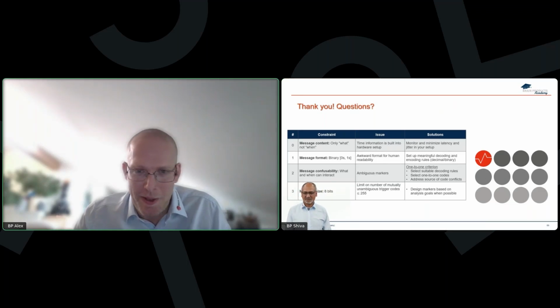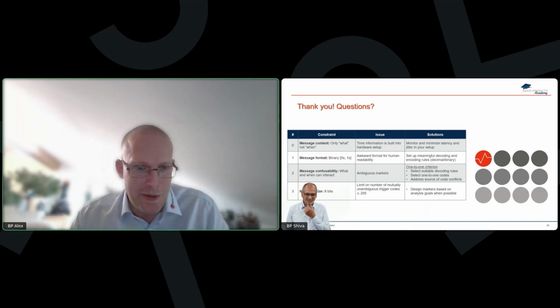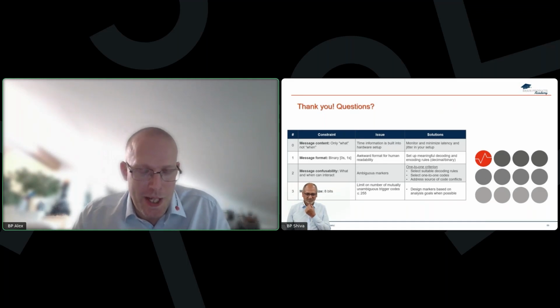Yeah, I don't think there's much more to say. As you said, sometimes this is necessary, but it comes with additional considerations you have to take into account because it changes the nature of the original pulse. So again, please check our resources if you have a trigger source that provides short pulses, and make sure you don't miss any triggers or get the wrong event information while doing that.